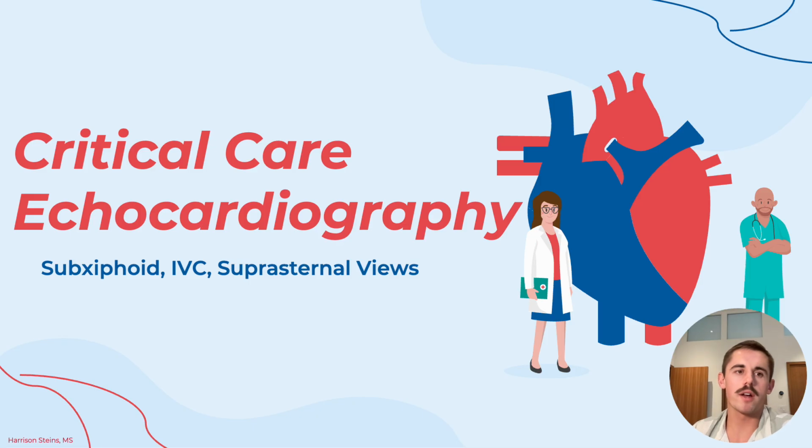So wrapping up, we have the subxiphoid, IVC, and suprasternal views. All of these are pretty vital in trauma and cardiac arrest. The subxiphoid view especially is vital in trauma and cardiac arrest, especially during compressions or when your parasternal long axis view is unobtainable, whether it be due to body habitus or access around the team you're working with.